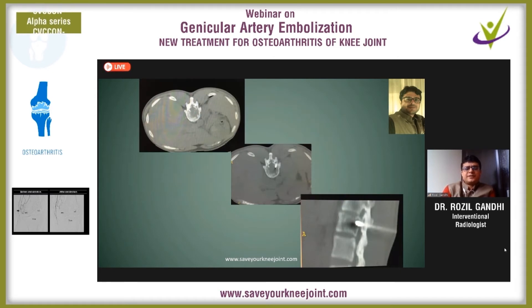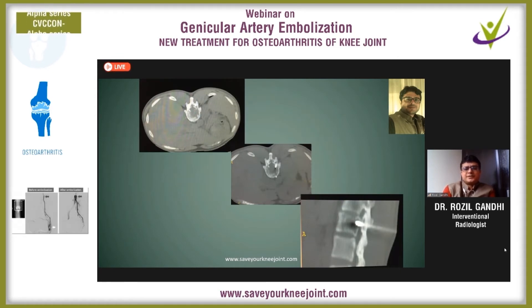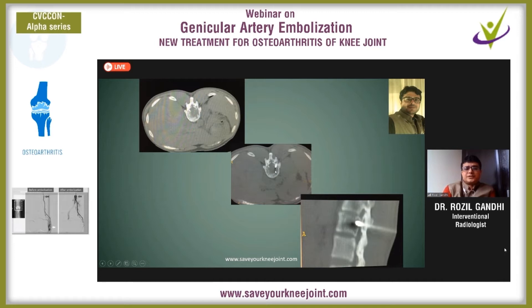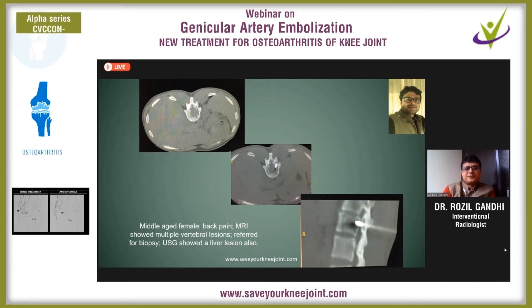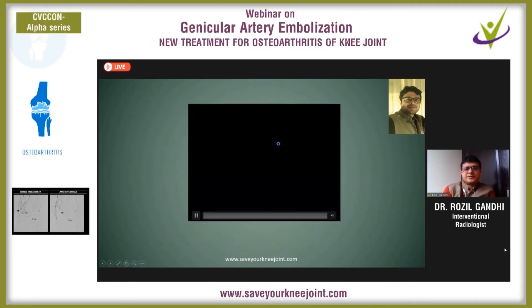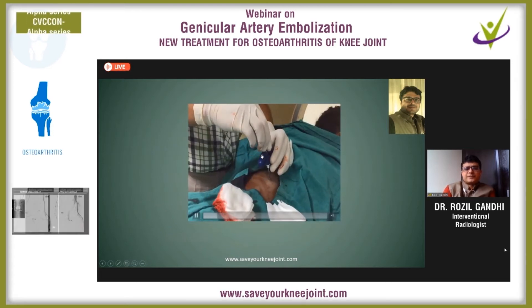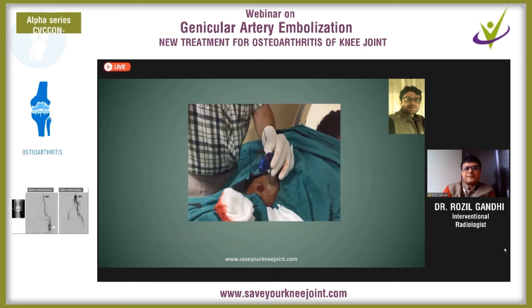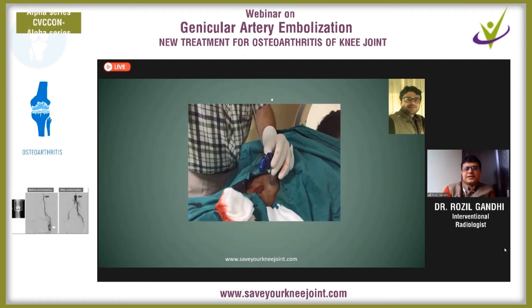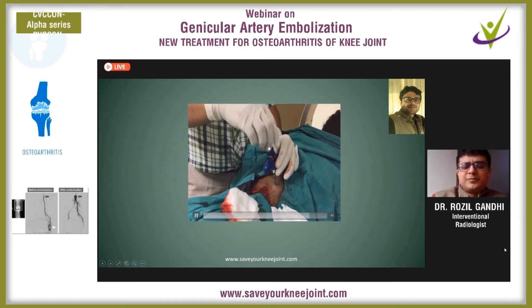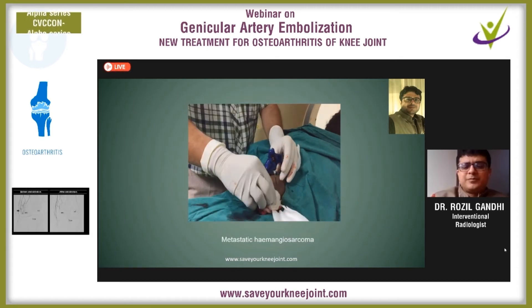Just to keep you all awake, this is the biopsy of the dorsal vertebra. The needle is typically in the lesion — the needle is in a female patient with multiple vertebral lesions. After removing the trocar of the needle, you can see high blood flow. So the needle is not in the aorta but in the vertebral body — this was a metastatic hemangiosarcoma.